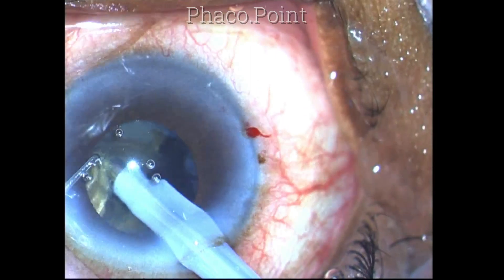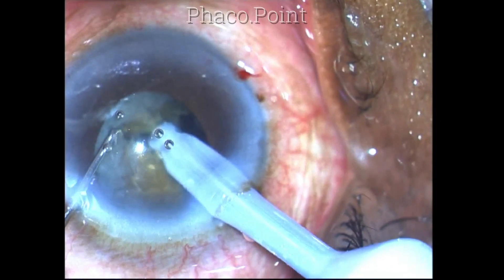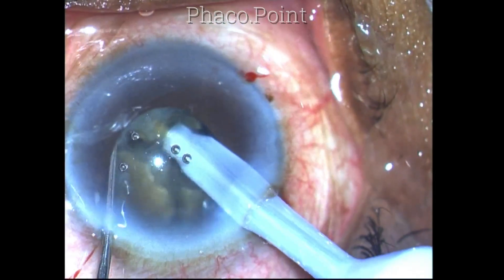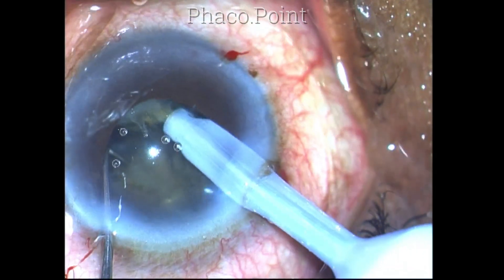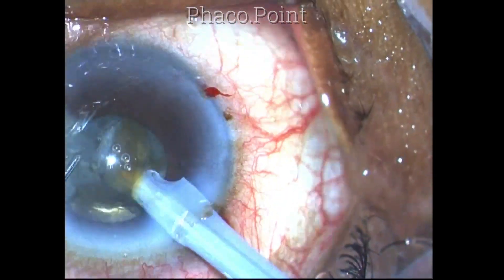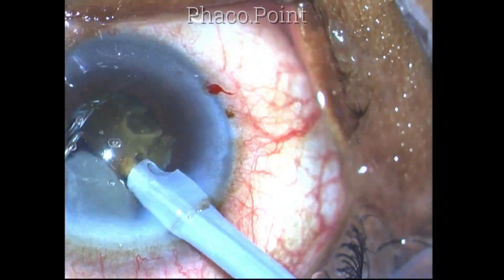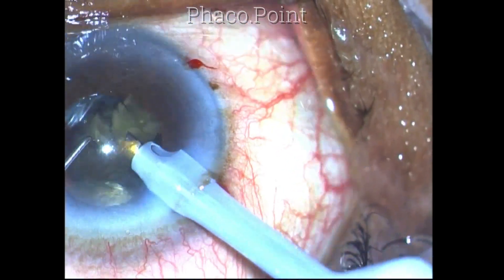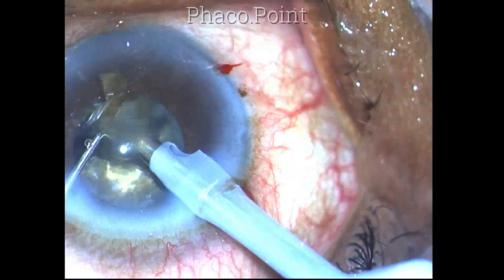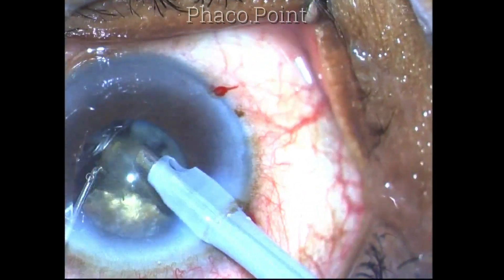The rotation of the nucleus should be done very slowly because excess pressure can easily produce zonular dialysis. The zonules tend to be weak in these cases. The posterior capsule also tends to rise up or trampoline because it is stretched and thin. Before mobilizing the fragments, you have to make sure that the crack has gone through and through and you have separated the nucleus fragments in their entirety. Once you have separated a small fragment from the main chunk, it is then gently phaco emulsified.